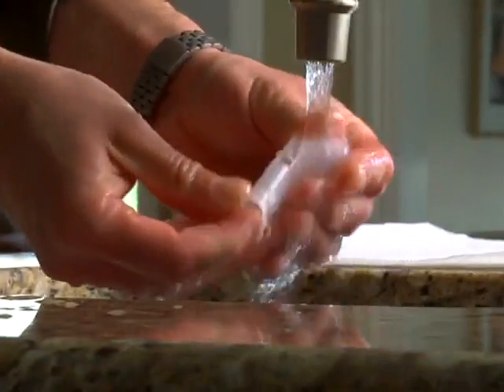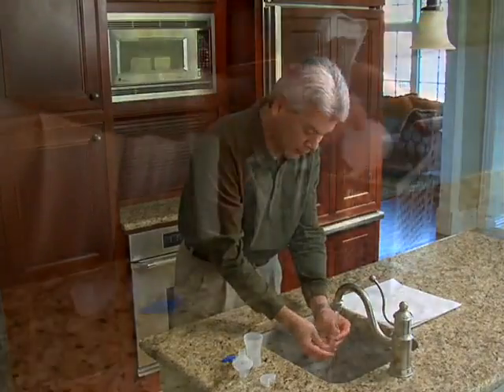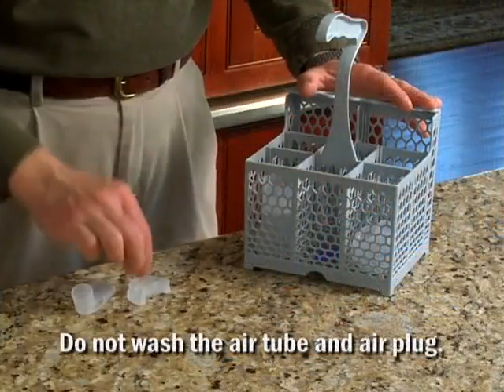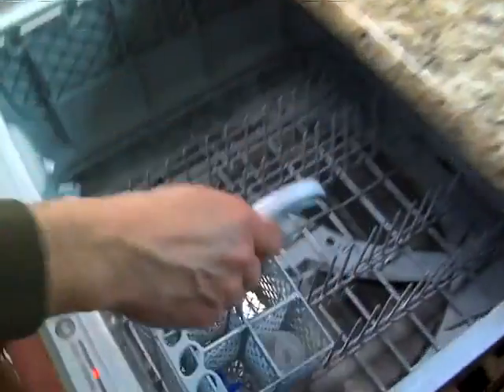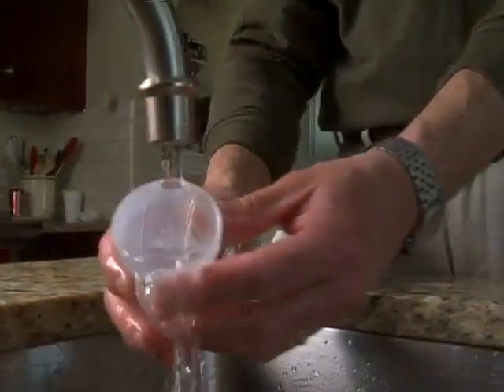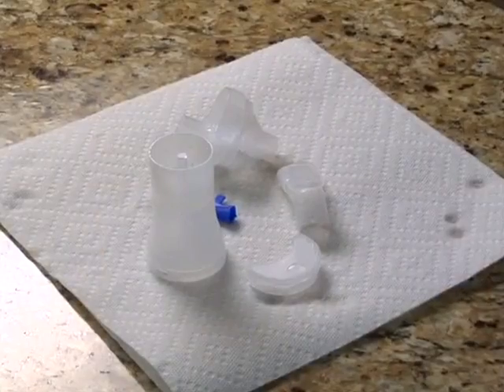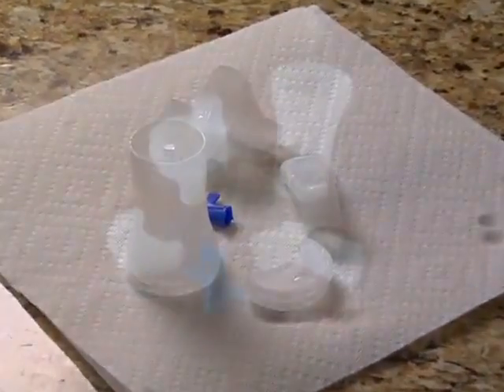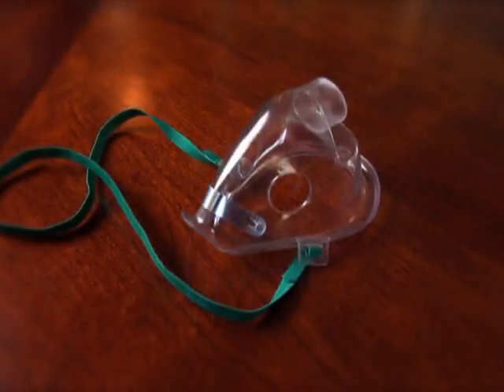Rinse all the parts of the nebulizer kit, the mouthpiece or mask, with hot tap water. These components are also top shelf dishwasher safe — place the parts in a dishwasher safe basket. Rinse the mask in hot tap water. Hand dry or let the parts air dry in a clean environment using a soft, clean, lint-free cloth. Disinfect the nebulizer kit, mouthpiece or mask after the last treatment of the day.